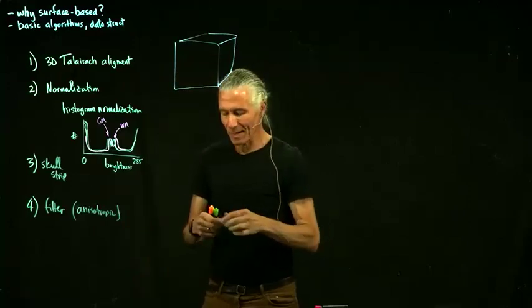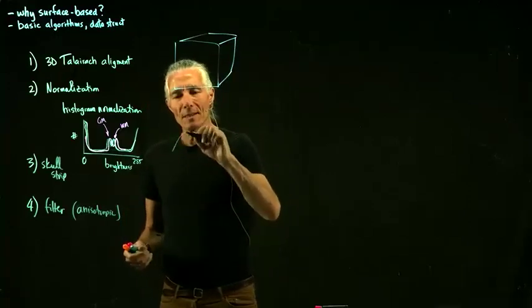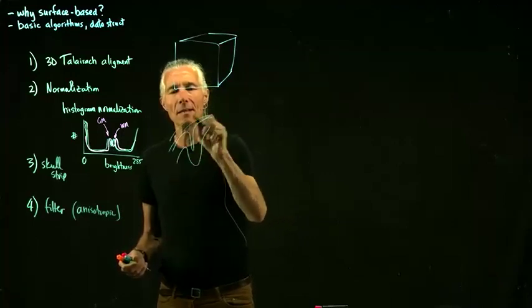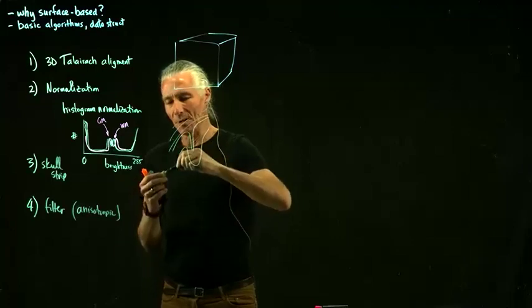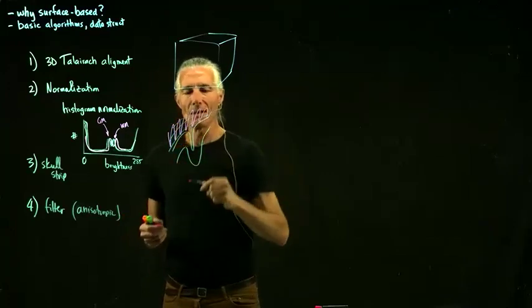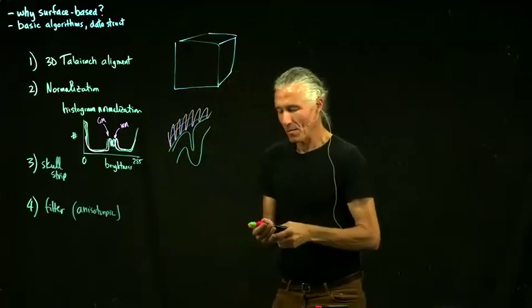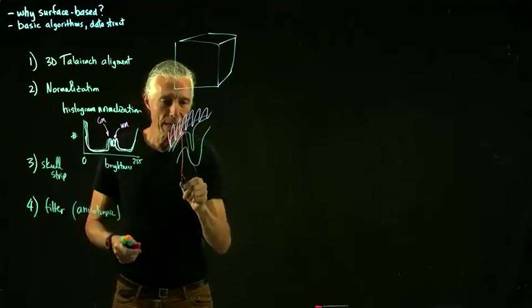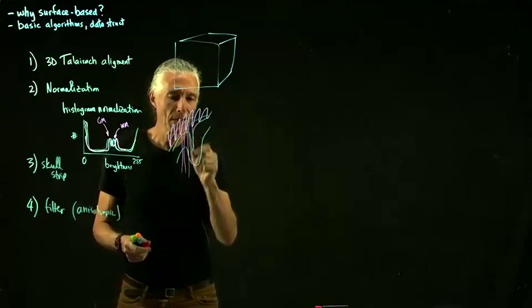So what we're trying to fix is, you've got a brain image like this, and now we've stripped off the skull. So now we just have the gray matter. So that's all gone. But when you look at the gray matter, if you look at it as a human, here's all the voxels.